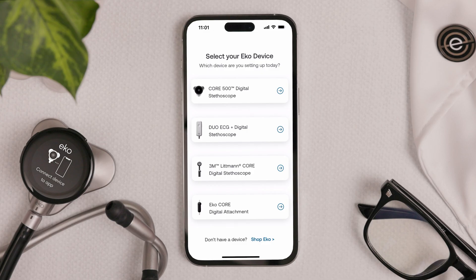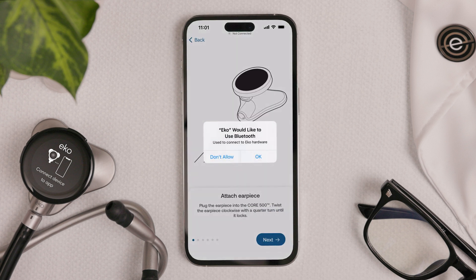Follow the on-screen instructions for connecting the Core 500. You'll need to connect your Core 500 to the app using Bluetooth pairing.